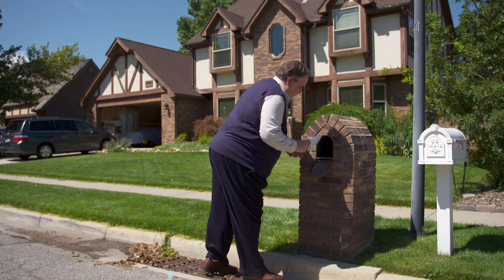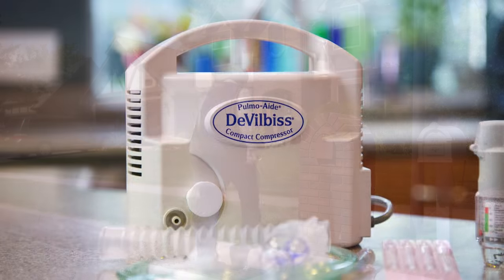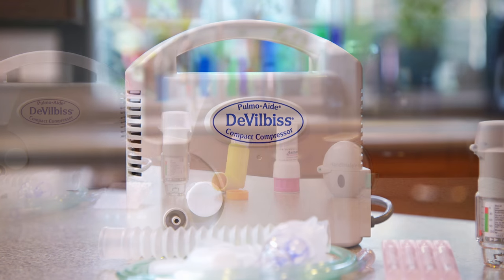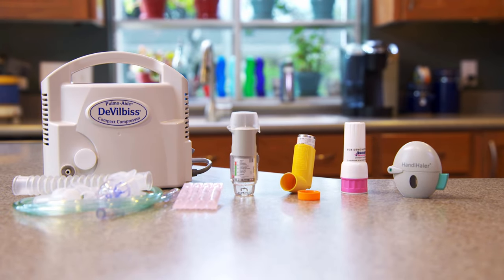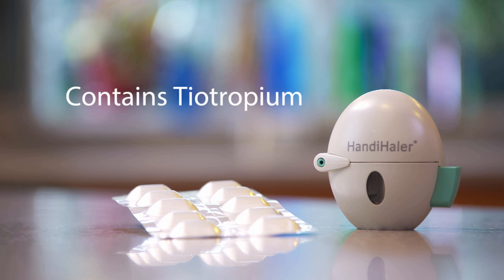Some people with breathing problems need to inhale medicine into their lungs. Inhaled medicines can be delivered by a device called a nebulizer, or by a variety of devices called inhalers. This video will show you how to use one dry powder inhaler called the HandiHaler. The HandiHaler delivers a medicine called tiotropium, which is also known as Spiriva.